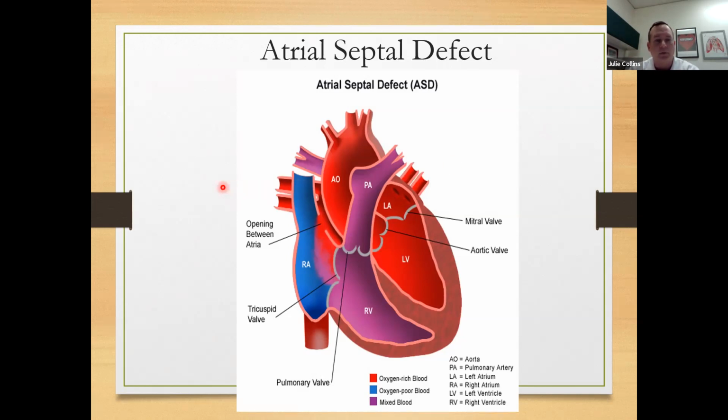By looking at this defect, what type of venous cannulation will we do? Will we do single or bicaval? Bicaval. Okay, why bicaval? Because you're entering the heart. Right. So we're going to want to have an SVC venous cannula and an IVC venous cannula. We're going to want to snare, because clearly we have to open up this cardiac chamber and expose the inside of the heart to the atmospheric air. And if we are not bicavally cannulated, we're going to suck a lot of air down our venous line and most likely get an airlock.